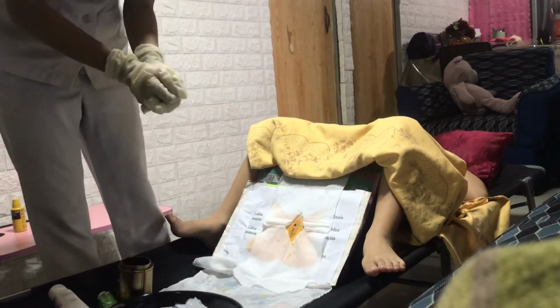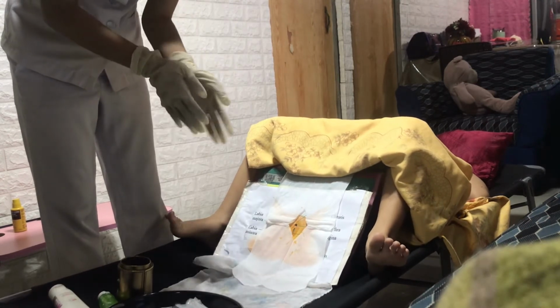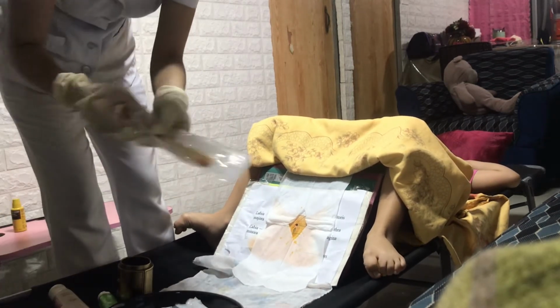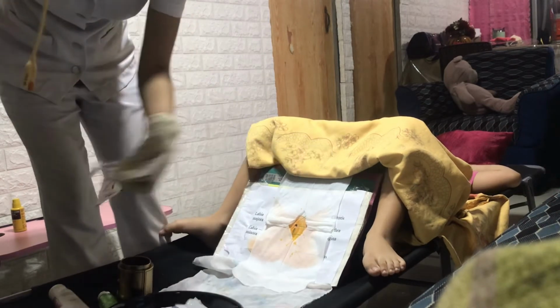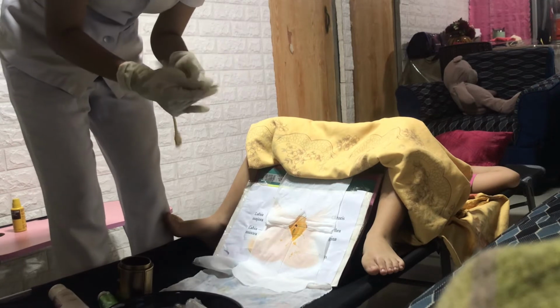Since we already put the eye sheet, I will next be lubricating the catheter for about 1 and 1/2 inches, being careful not to plug the eye of the catheter. We're going to lubricate 1.5.